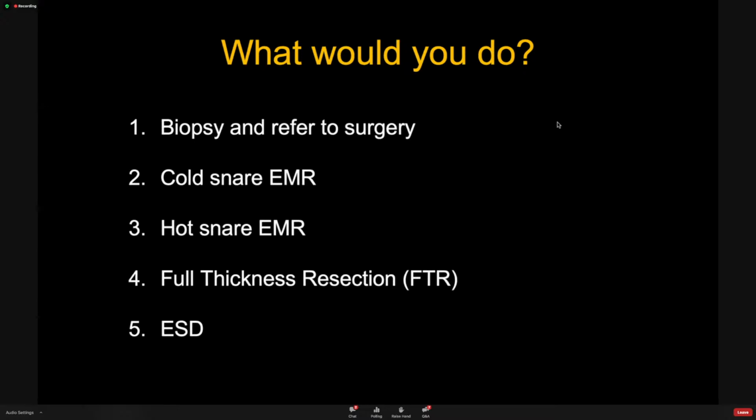As you can see, hot snare EMR and ESD were chosen at a similar rate. Cold snare EMR is 9%. Very good. So what about you, Professor Kim? What would you do? Actually, I'll do just the hot snare EMR. Okay. And Professor Sano? Me too. I perform the standard hot EMR.